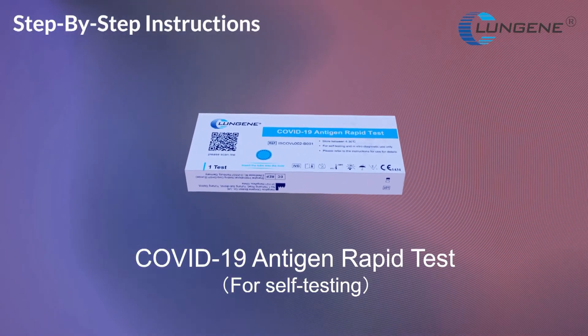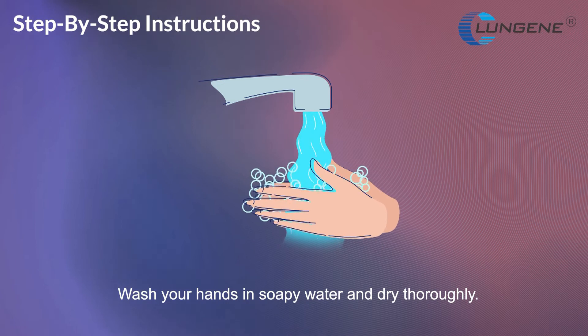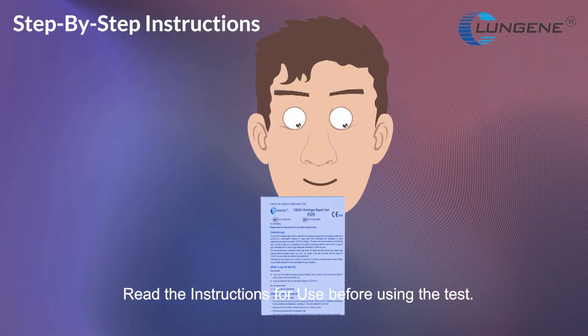COVID-19 Antigen Rapid Test self-testing. Wash your hands in soapy water and dry thoroughly. Open the kit and check the components before use. Read the instructions for use before using the test.